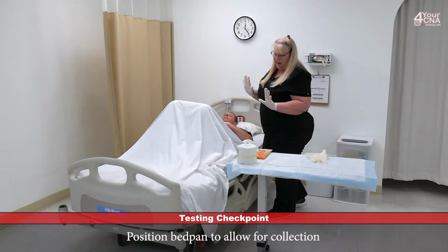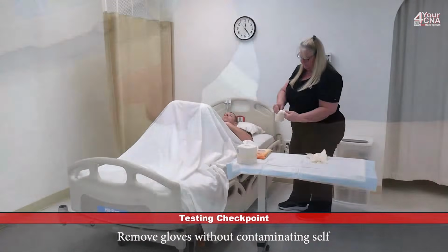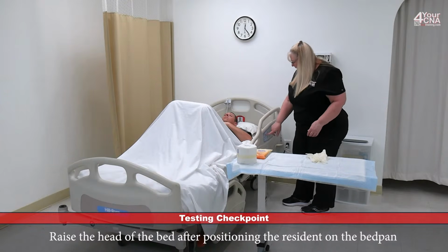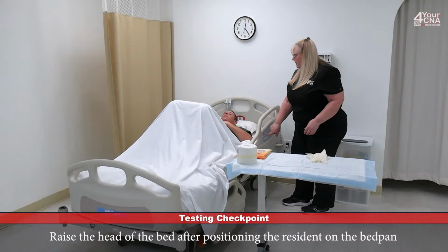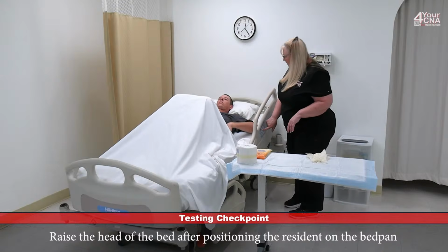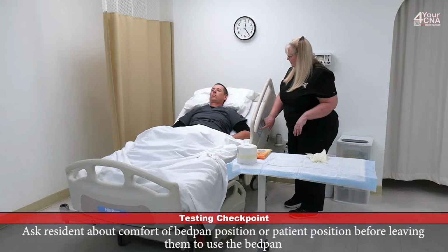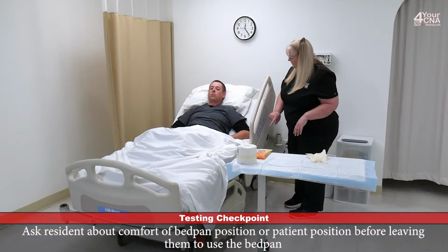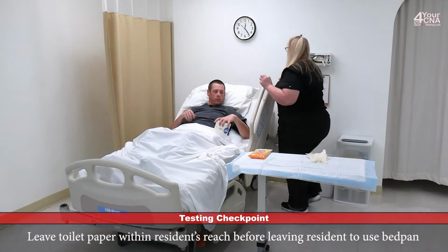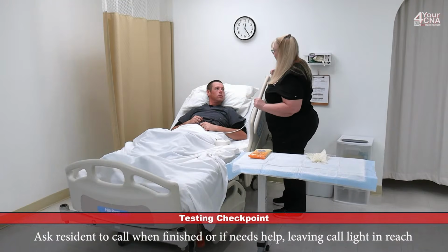All right. And now I can remove this set of gloves. We'll throw these gloves away, and I'm going to put the head of the bed up. Mr. Jones, I'll put the head of the bed up now. That bedpan may shift a little bit. Feel free to move it as you need to, and let me know when you're comfortable. And you can relax your legs. So you comfortable? Okay. Here's your toilet paper. Here's your call light. I'm just going to step on the other side of the curtain and let me know when you're done.